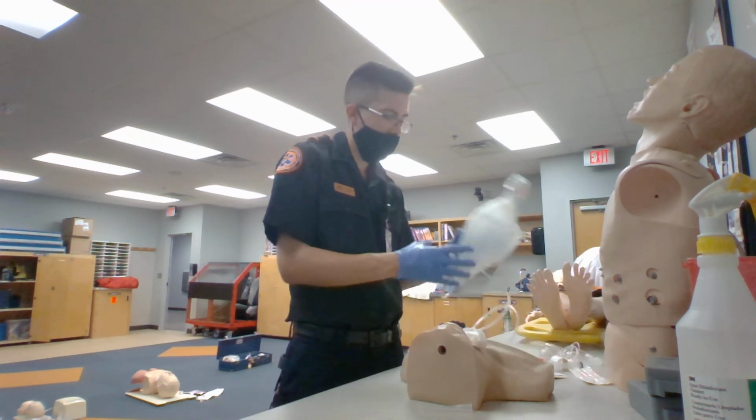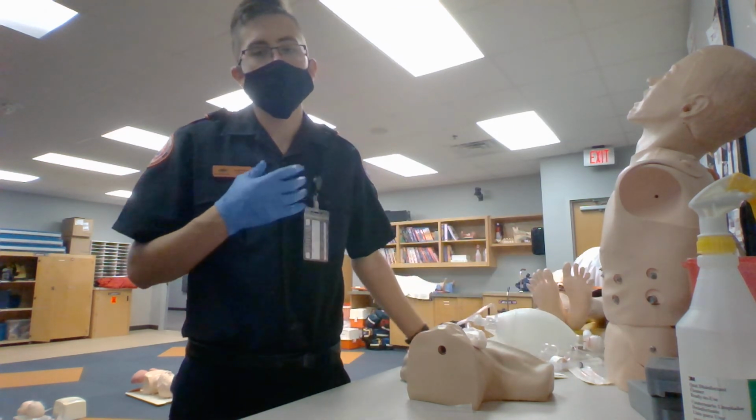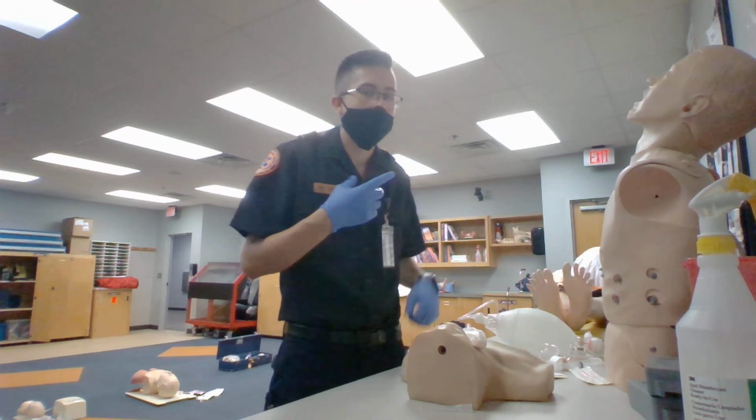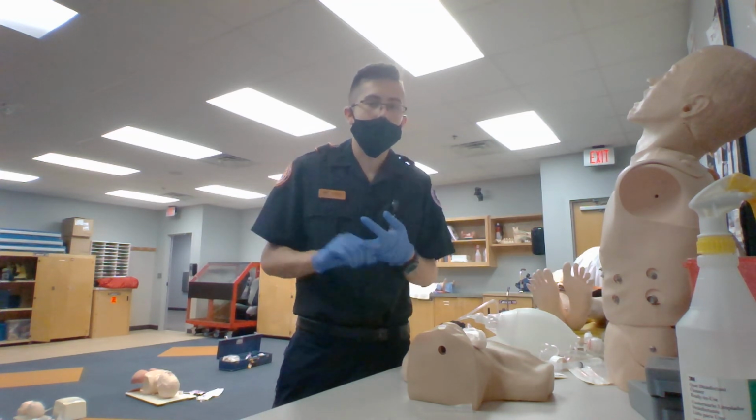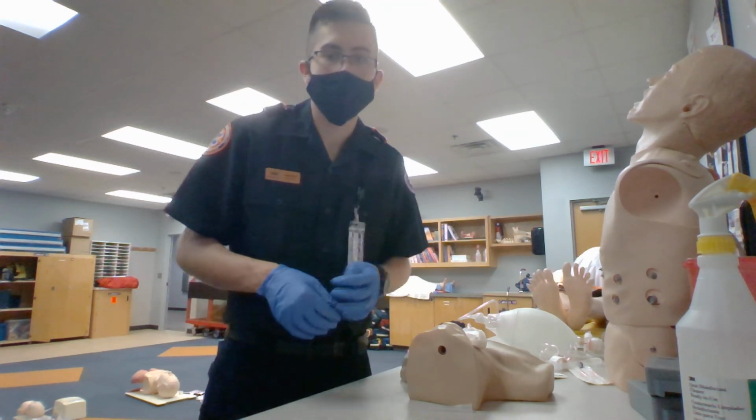And then after I'll continue to monitor my patient for any changes in patient condition, as well as adequate chest rise and fall. I'm going to be monitoring their SpO2, signs of hypoxia, and capno, and then assess for any change in patient condition while en route to the hospital.